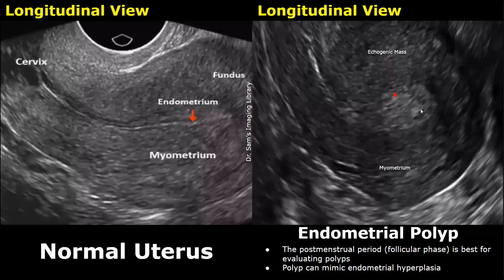On ultrasound, the postmenstrual period, also known as the follicular phase, is best for evaluating polyps because during this phase the endometrium is thin, which makes it easier to differentiate between uterine masses and normal endometrium. However, a polyp can mimic endometrial hyperplasia on ultrasound, in which the endometrium becomes abnormally thickened.